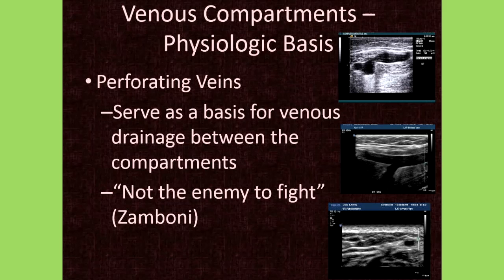We are much more respectful of perforators than we used to be. We used to think that if perforators were enlarged and had reverse flow, they were absolutely abnormal and should be treated. We find that that's not correct, that many of these incompetent perforators will regain competency after treatment of the saphenous incompetence.